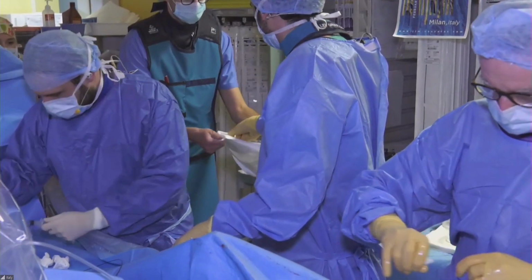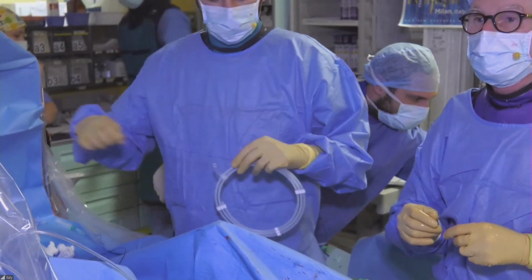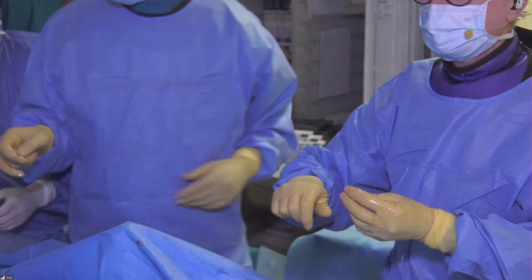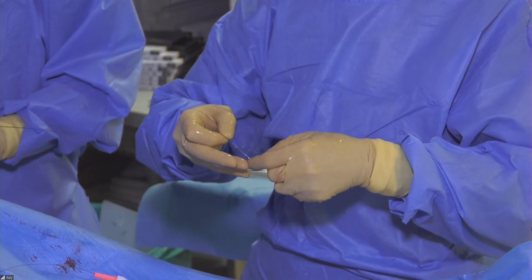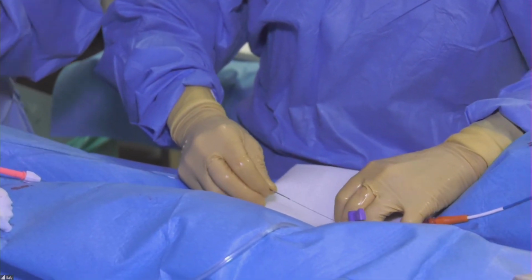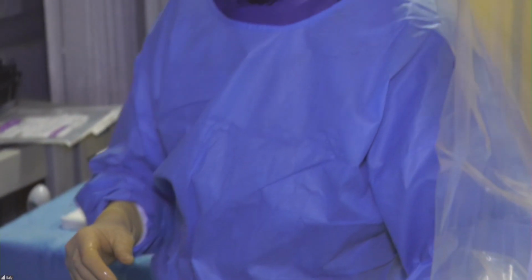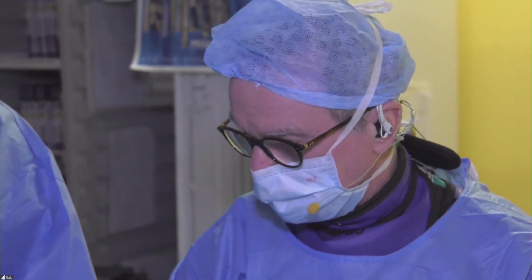So I think over there the vessel is definitely 3.5. Yeah. Can we make a measure just close to the tightest part? Okay, so this is a 3.5. Then after we place the stent, we measure again the pressure, and then we go to Dr. Giannini in the other room. Hold the wire a little bit, pull back this wire. Okay.